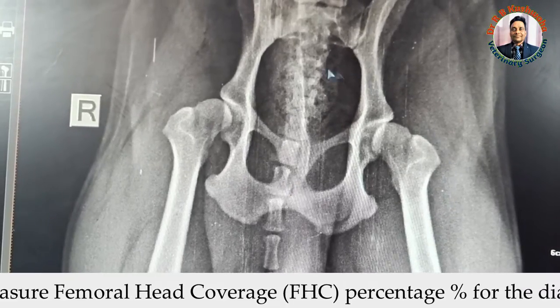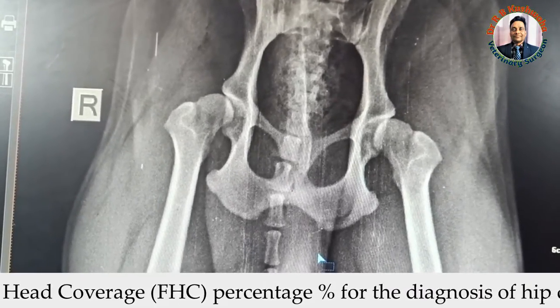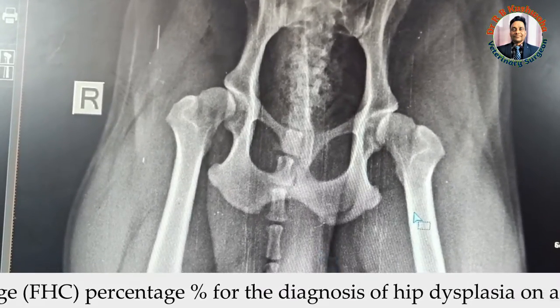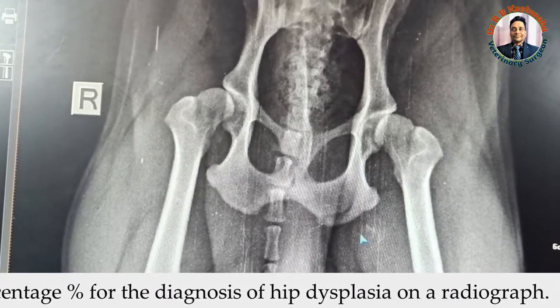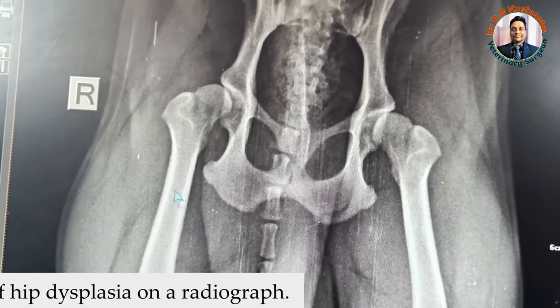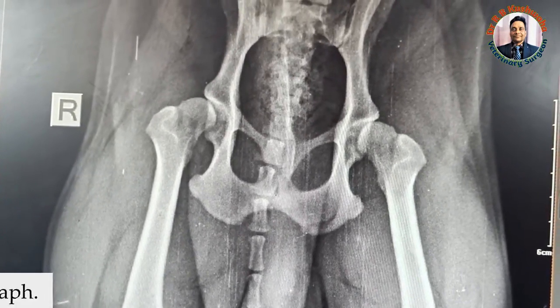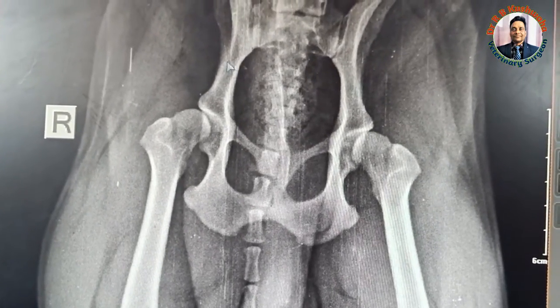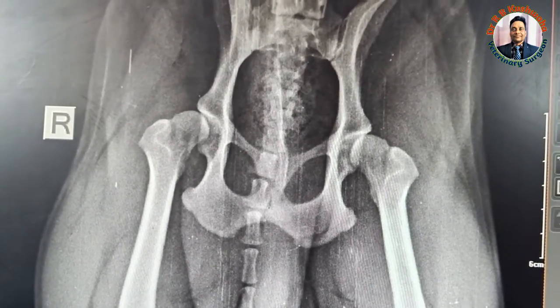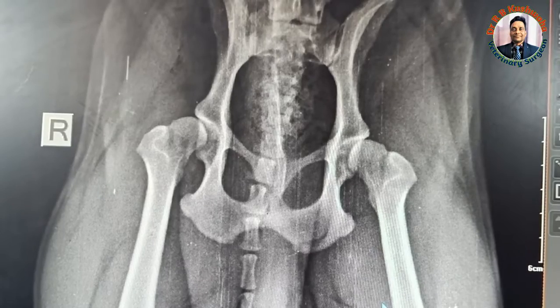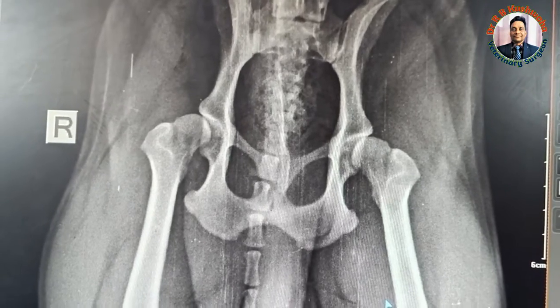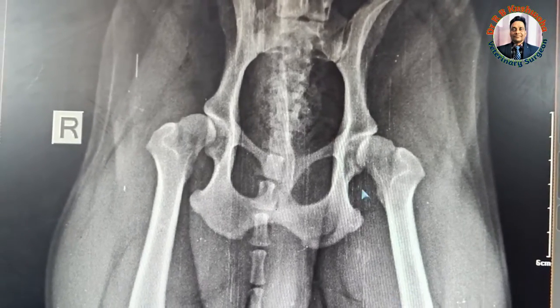You can see this is the ventrodorsal view of the hip joints. This view has been taken with both hind limbs extended, which is the ideal radiographic view for the diagnosis of hip dysplasia.